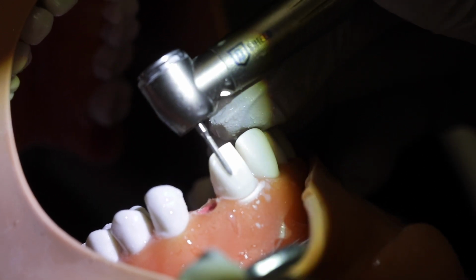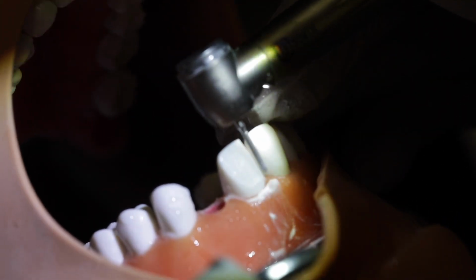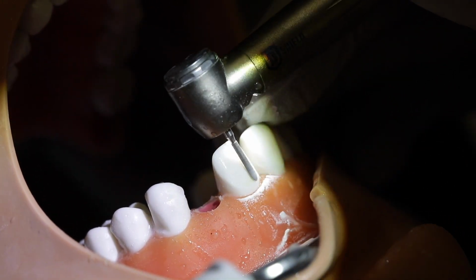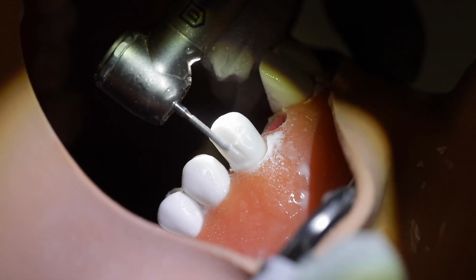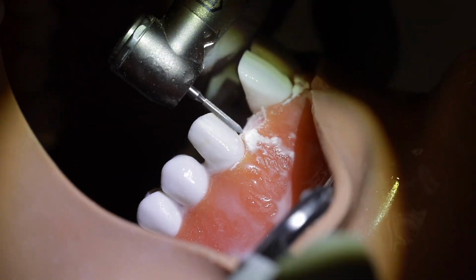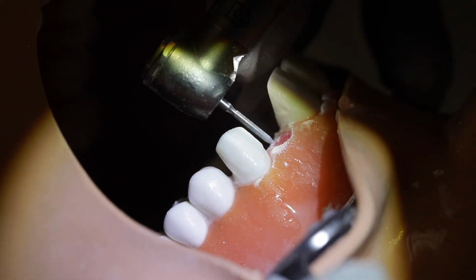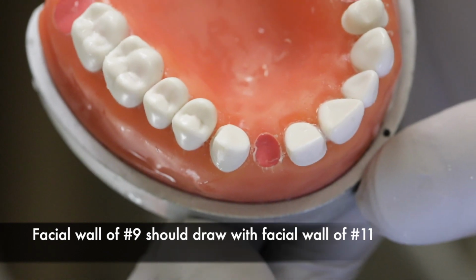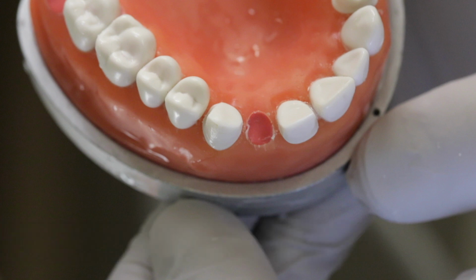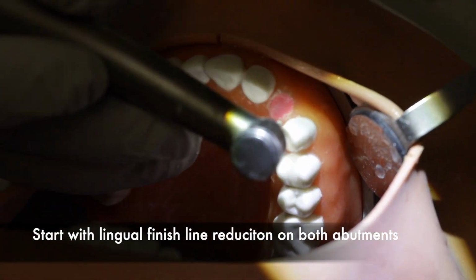After this, start with minimal preparation on the facial of 9 and 11. Start with making minimal depth grooves and connect the grooves together. Check from the occlusal view and make sure that the walls that you prepared have a good path of draw. This is usually achieved by closing one eye, looking with one eye on both preps, and visualizing both finish lines at the same time.